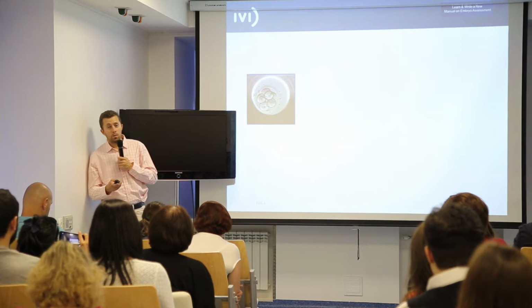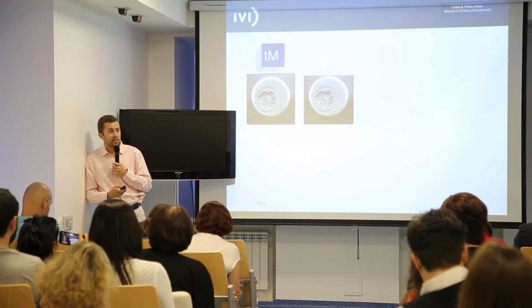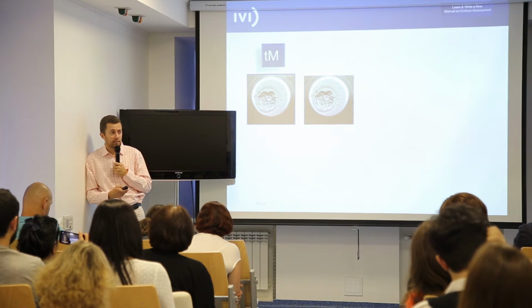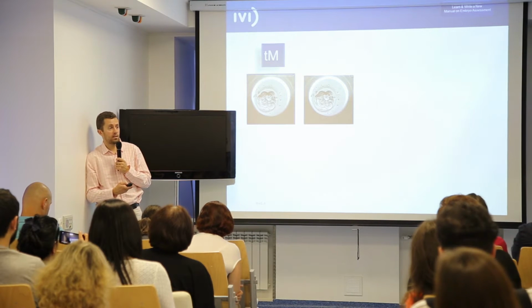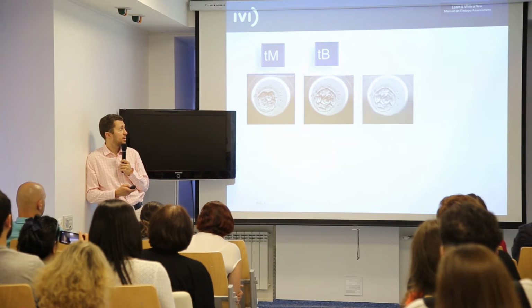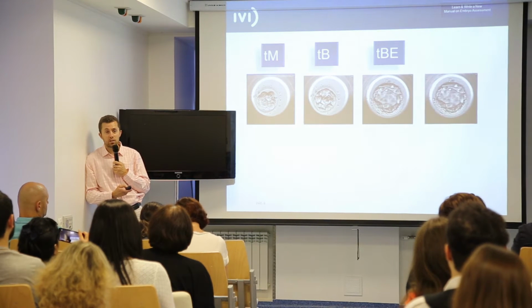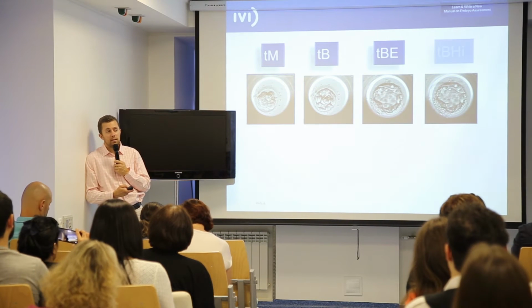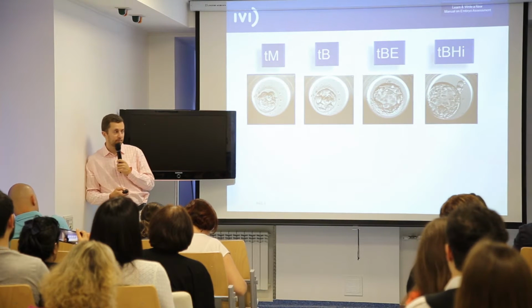When we go forward in embryo development, there are other timings of cleavages or parameters that are slightly more subjective. For example, the time of compaction. Maybe we can have differences between us when we consider that the embryo is compacted, or when the embryo is becoming a blastocyst, or when the embryo is becoming an expanded blastocyst. Obviously, it's probably easy for all of us to detect when the embryo is becoming an expanded blastocyst.